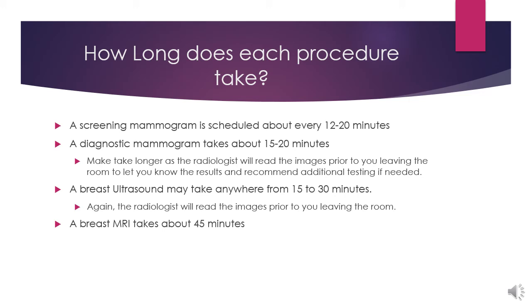gets dressed and leaves the building, they will be sitting waiting for the radiologist to read the report. The radiologist will then send them to get an ultrasound, which is in the same building. Once everything is read, the radiologist or a nurse practitioner will come out and give the results to the patient to let them know what the results were right now.